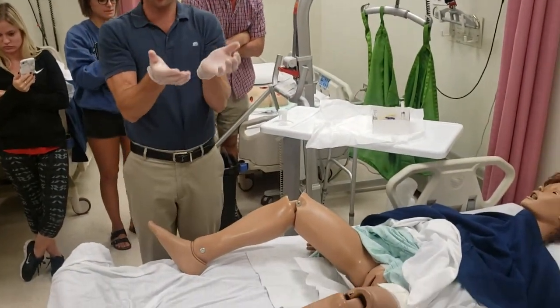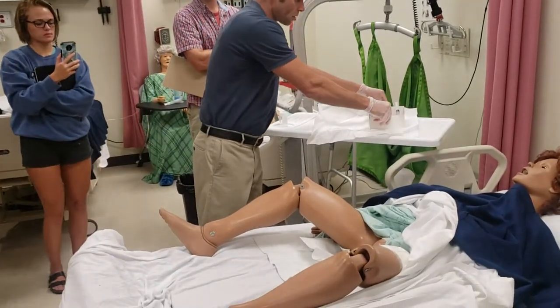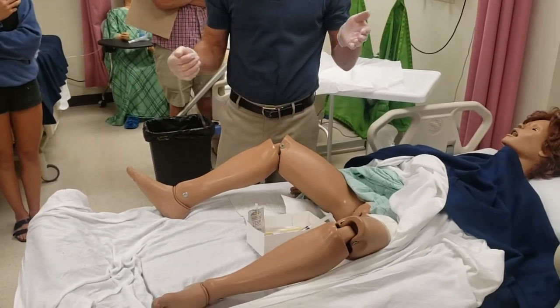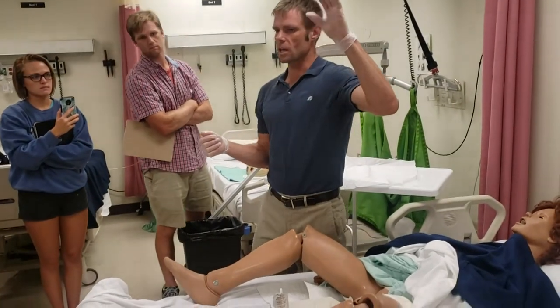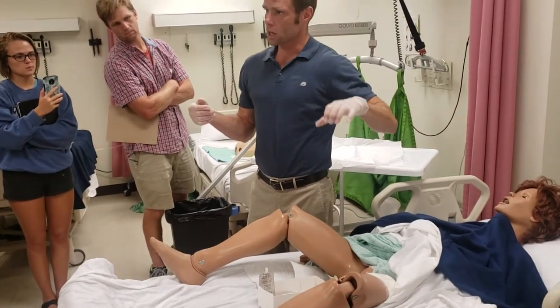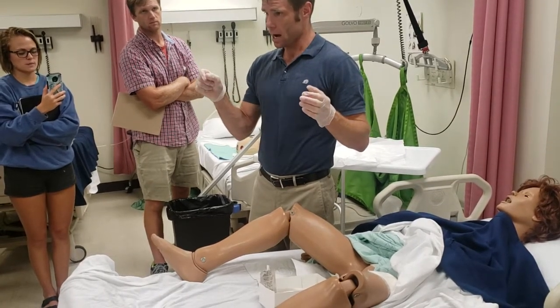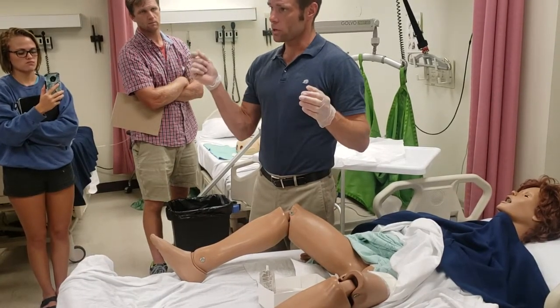You can also have colleagues in the room lift up the patient's hips, or the patient can lift up for you. Now I'm still sterile — I can come over here and grab my box. I just need a drape between the box and the patient. Then I'm going to purposely contaminate my non-dominant hand. My non-dominant hand is my left side. I set up on the patient's right side so that when I'm ready to insert, I can have the correct hand. With a non-dominant hand it's hard to do things, and I'm about to insert a catheter and try to hit a hole I may or may not see — so I need a steady hand, and I use my right hand for this.